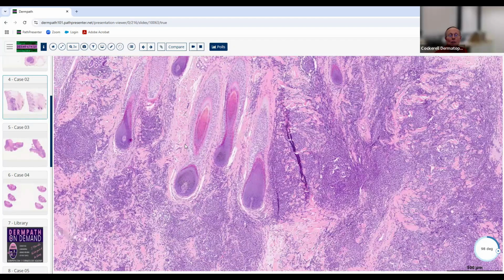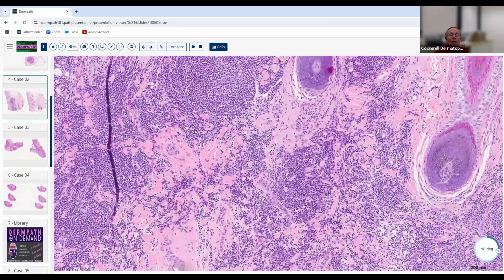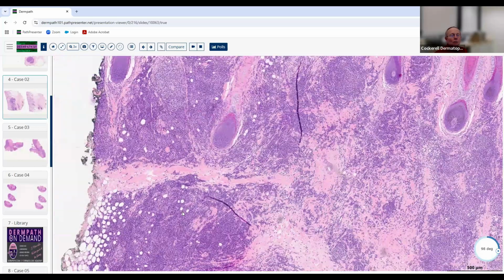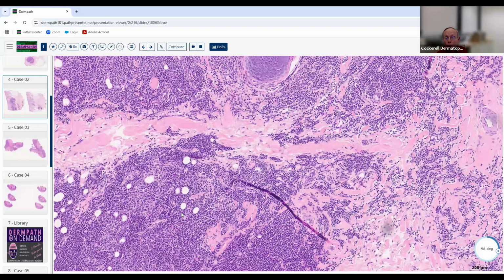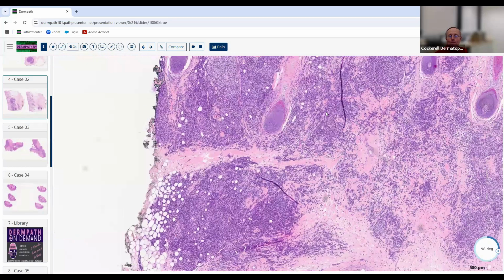So when you see something that's basophilic at low magnification like that, you say, well, it could very well be lymphoid, but let's make sure it's not neuroendocrine or some other poorly differentiated small blue cell neoplasm, especially if this were a young person, a child, for example: neuroblastoma, Wilms tumor, those kinds of things. Blue is bad, especially when it's not well circumscribed in something like this. So we'd be concerned about this.